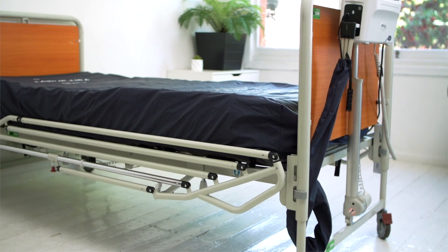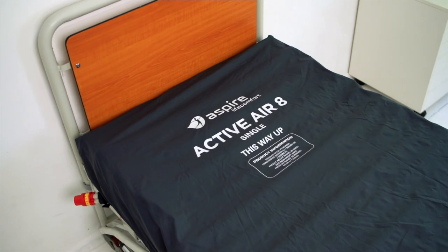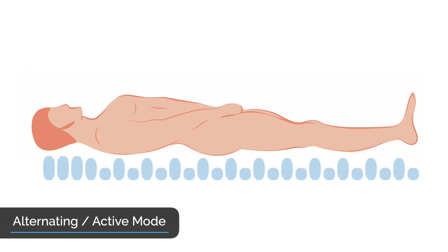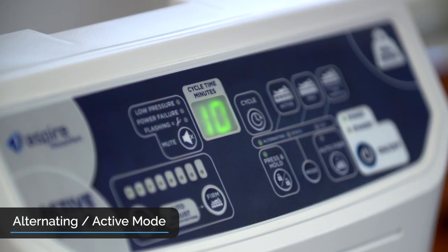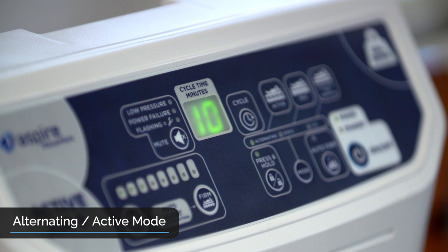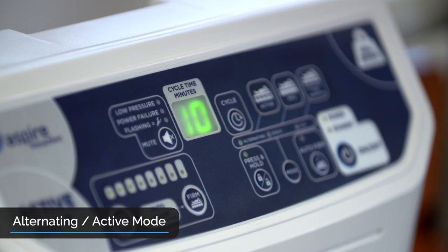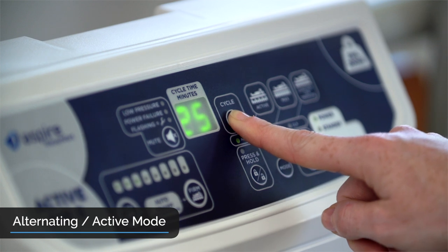To get the most from your Active Air 8, it is important to understand its key features and functions. There are 4 different modes. Alternating mode means that cells move up and down in a 1-in-2 pattern, allowing reactive hyperemia. This mode is vital to prevent and manage pressure injury and should always be used for those at high risk. Alternating mode always defaults to a 10 minute cycle on initial setup, which is recommended for optimal protection and management. However, if clinical needs indicate, cycle time can be adjusted by pressing the cycle button.